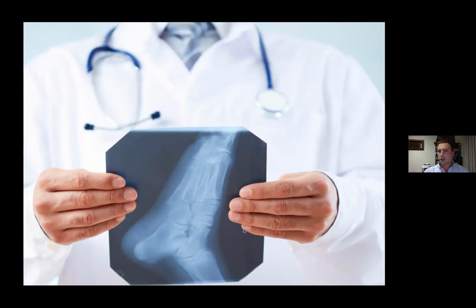So getting the diagnosis right is really important, and factoring shockwave into an overall treatment plan is where this comes into effect. So I really take time to properly clinically evaluate patients so that I can understand when is best to time the introduction of shockwave. And this has a considerable impact in terms of whether patients do well or not. In some cases, I've seen patients who have come in with a various problem and they've been treated elsewhere. And they come in and say things like, well, I've had shockwave and it didn't work. And ultimately, the diagnosis hasn't been correct, or it's been implemented at the wrong point in their treatment plan.